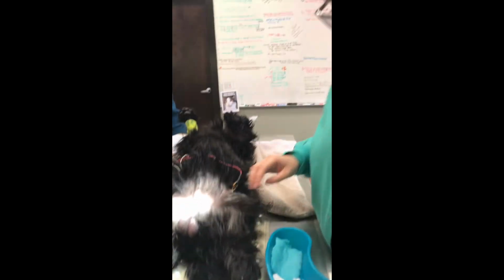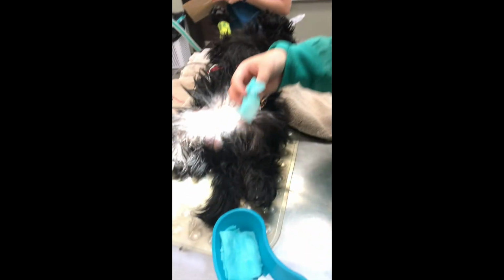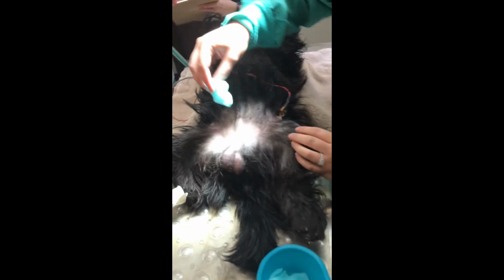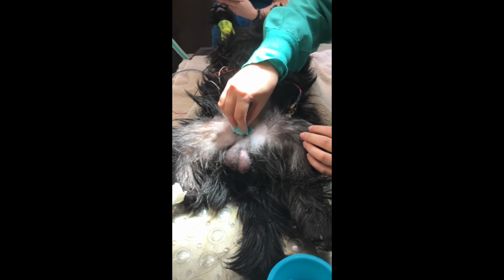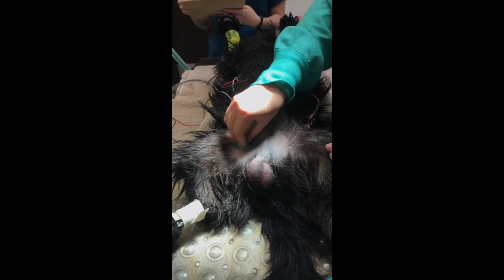Now we're going to start scrubbing. We're going to use chlorhexidine scrub and alcohol. We're going to do a bullseye scrub. If anything touches hair, that scrub is done.